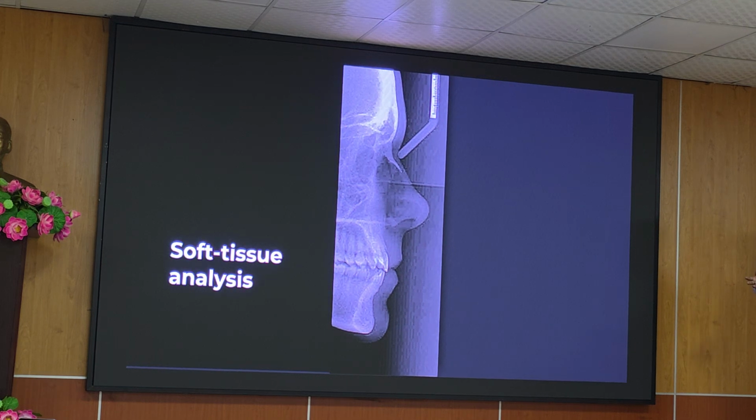Brief and very precise, to the point. Whatever is actually useful in your clinical practice is what we want to really look at. Dạ, thì thầy không muốn làm các anh chị quá tải với các cái thông số, thì thầy sẽ trình bày một cách ngắn gọn và chính xác những chỉ số mà có thể hữu ích cho cái việc quan sát của anh chị.